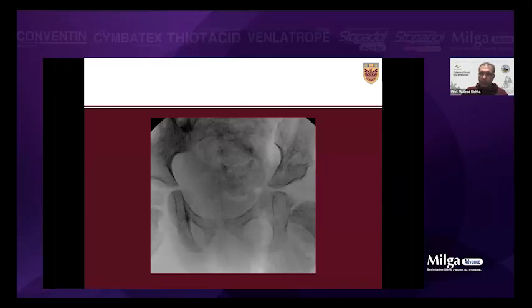Use number 1 Vicryl to close it and make sure it's matching, not inverted, not externally rotated, because this is a growth plate and this is apophysis and this needs to grow. And there are some reports that it causes deformity in the future for the pelvis, especially a new paper that came from San Diego recently as a long term, but it's cosmetic mainly.